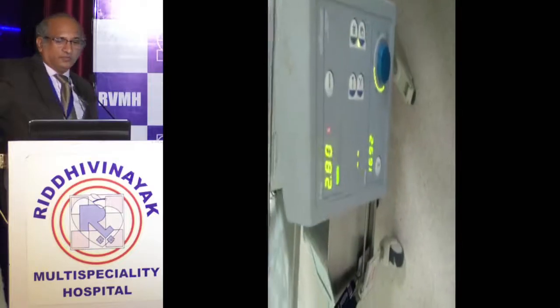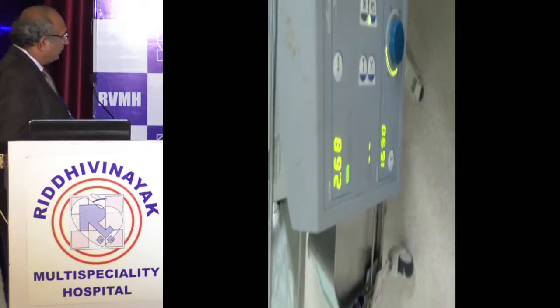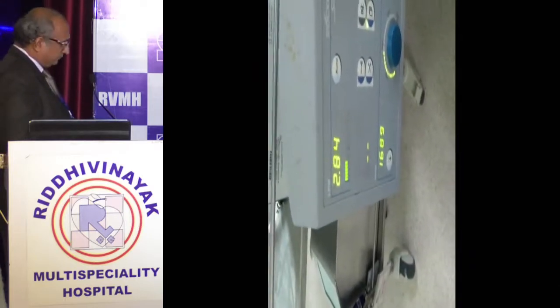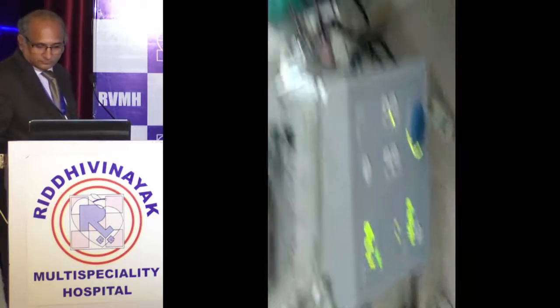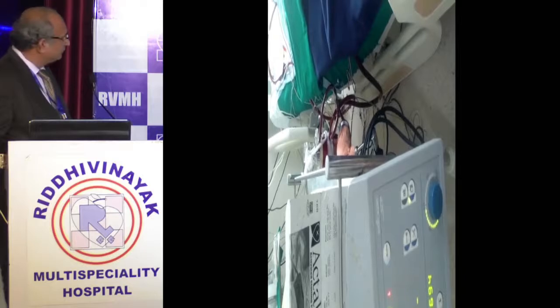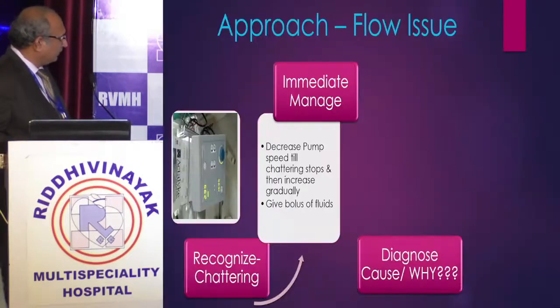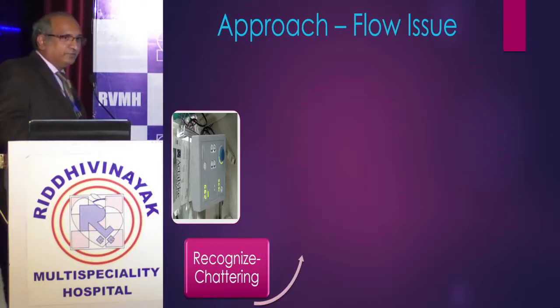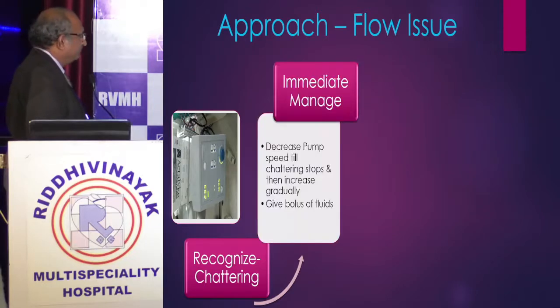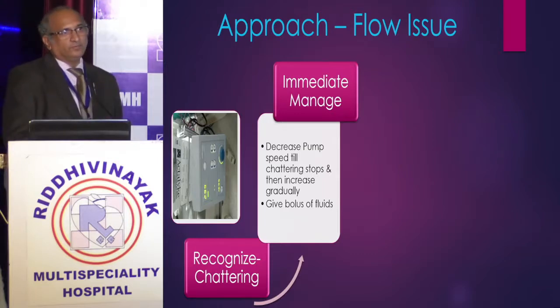Flow is not constant and there is a chattering. Okay. So you diagnose it rightly, it's chattering. So what should be the immediate management? The moment you say chattering, what will be the immediate management?